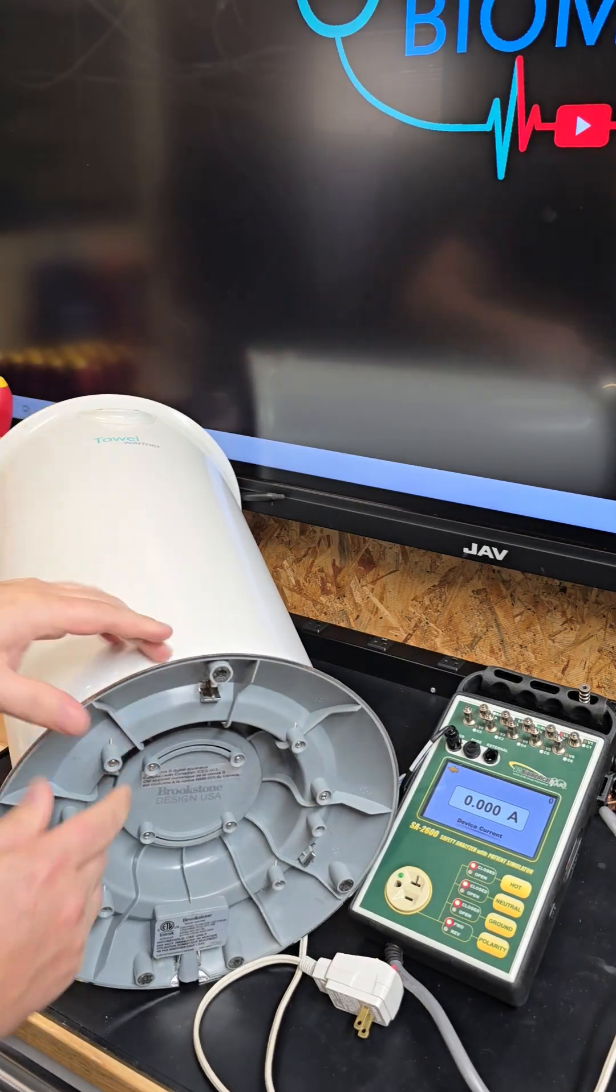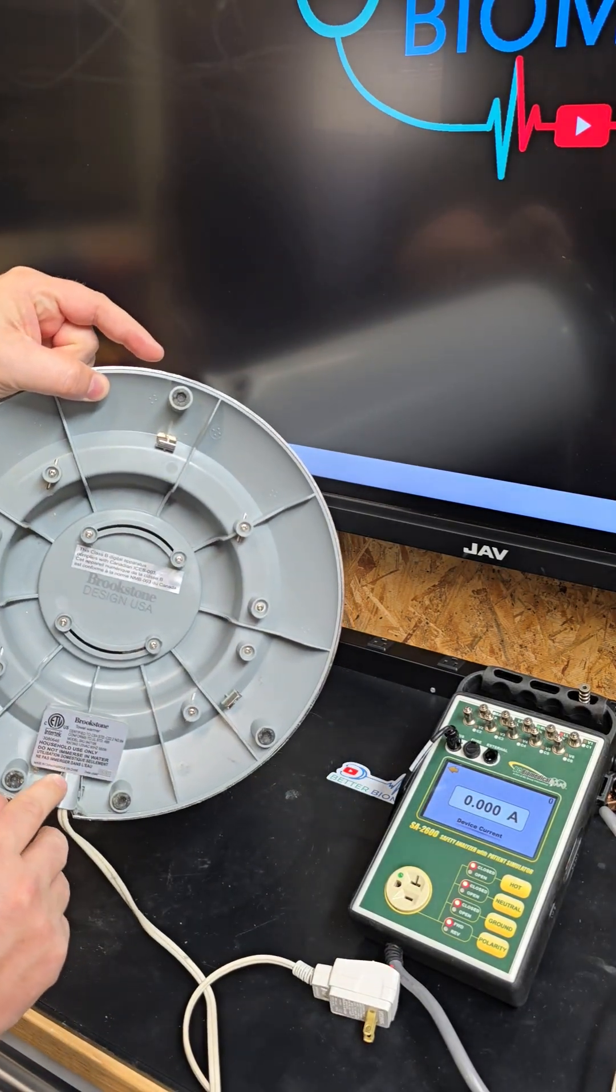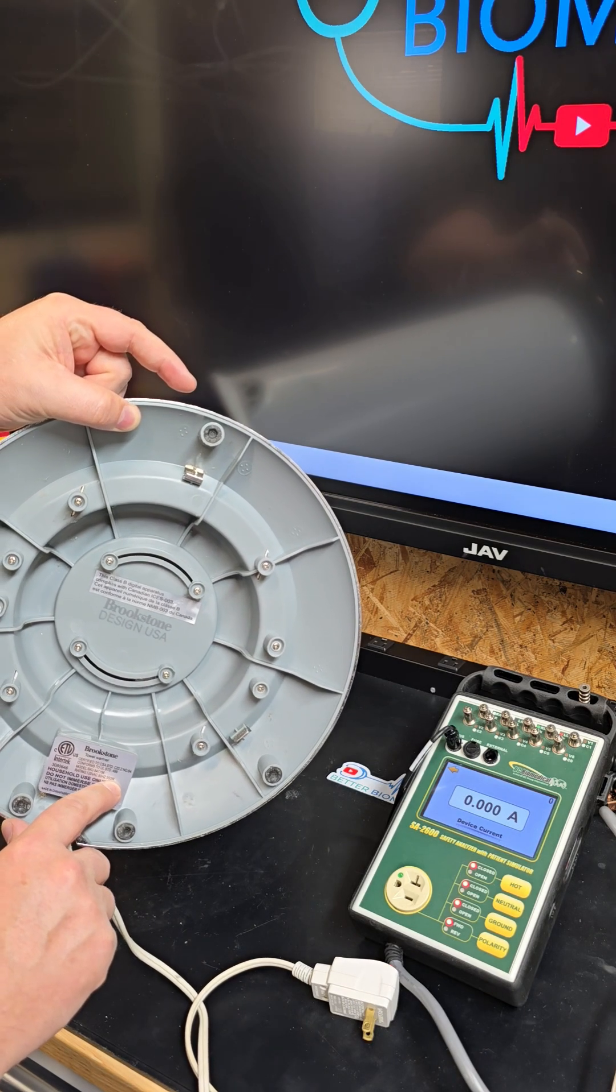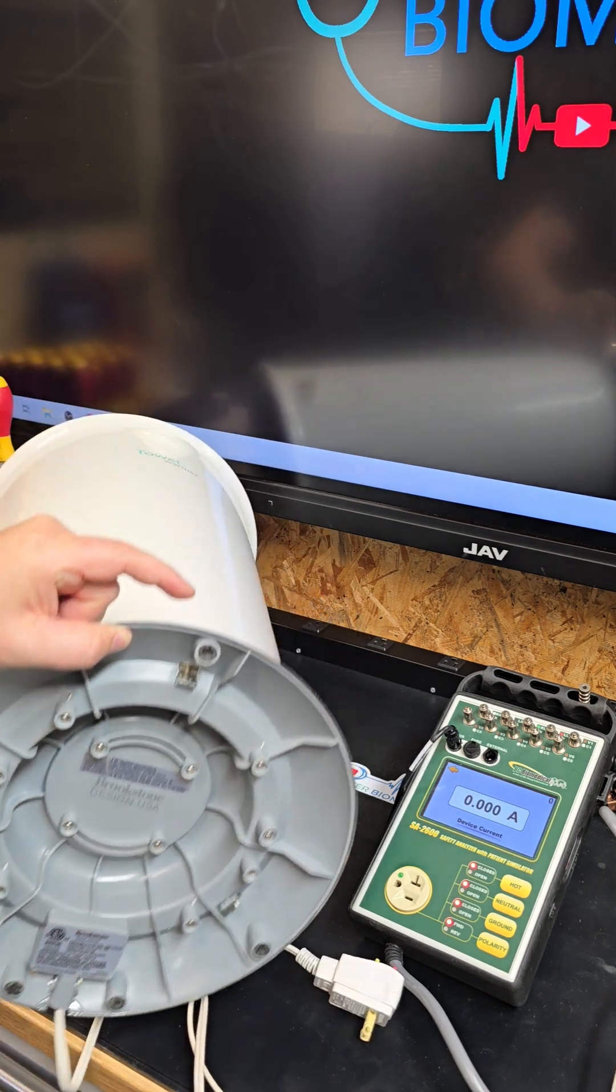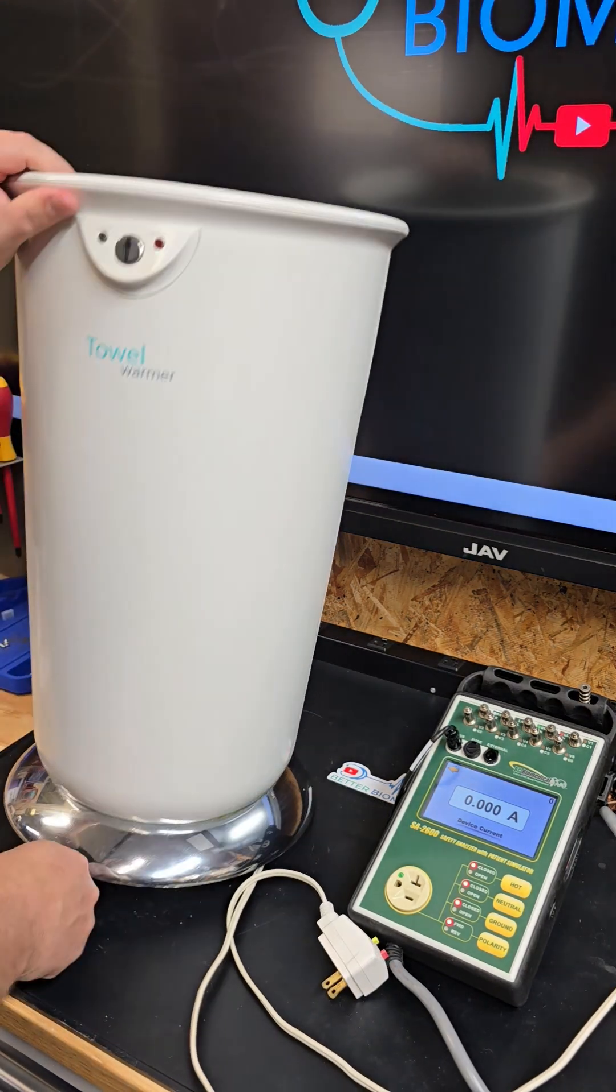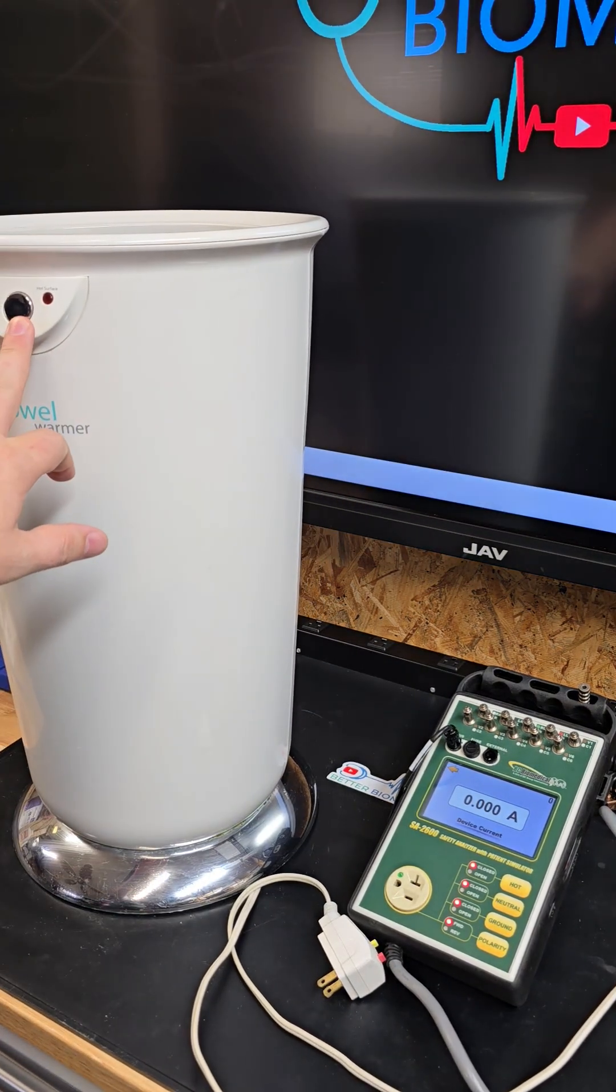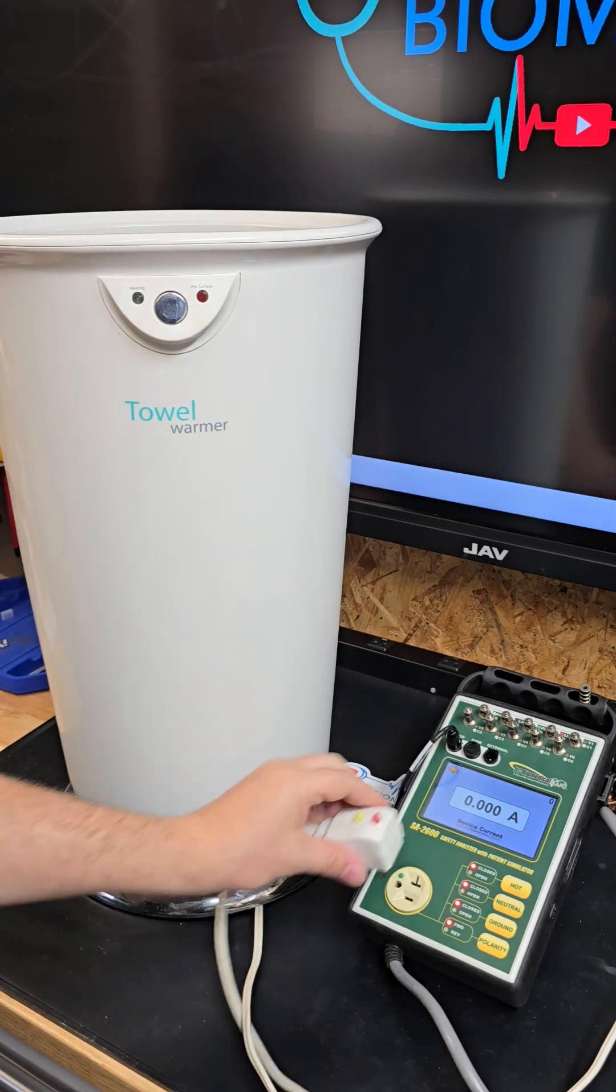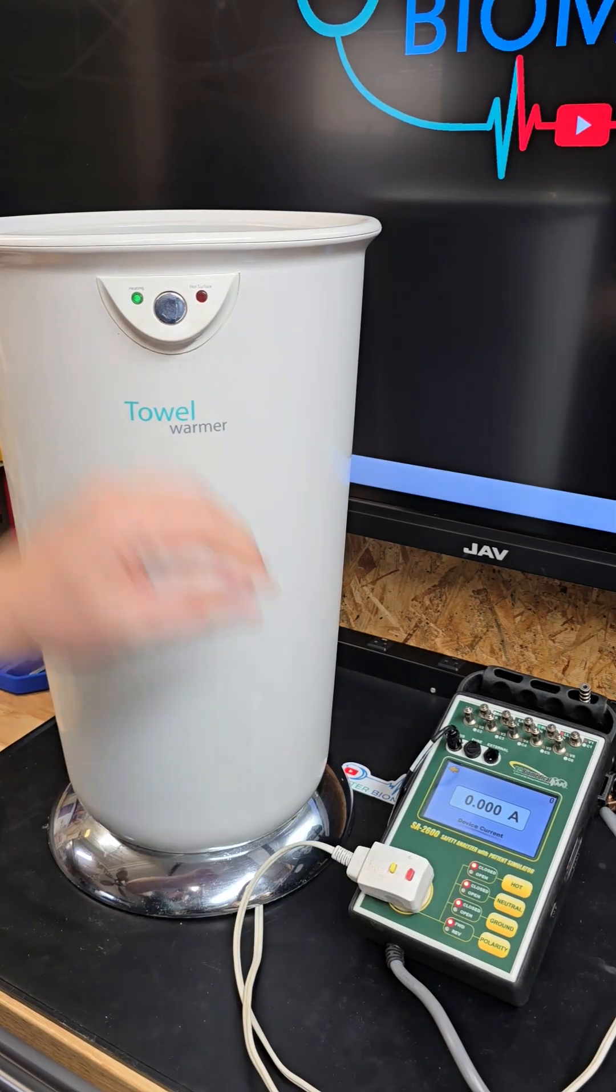If you look down here at the bottom on the certification label, it says we should be pulling about 550 watts. That's about 6 amps. By plugging it in, it shows it's turned on and should be in heating mode, but it's not pulling any current whatsoever. That shows we have bigger problems.